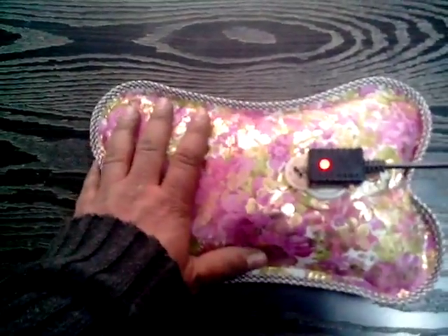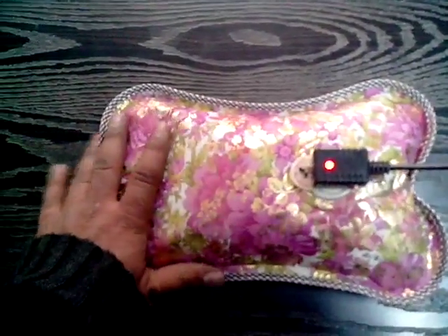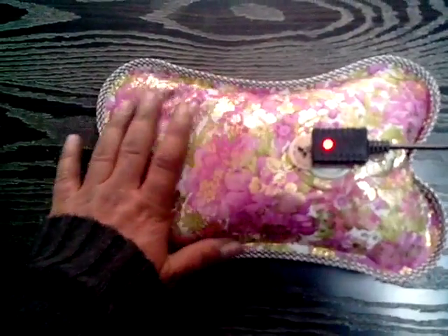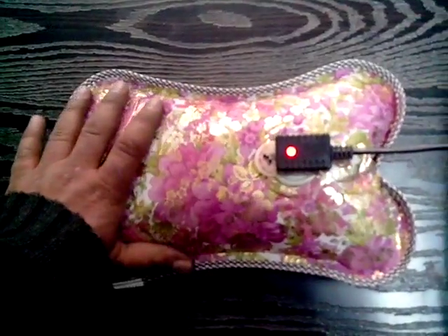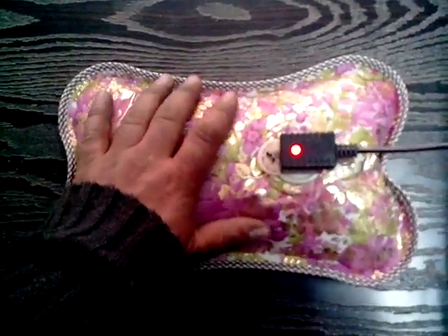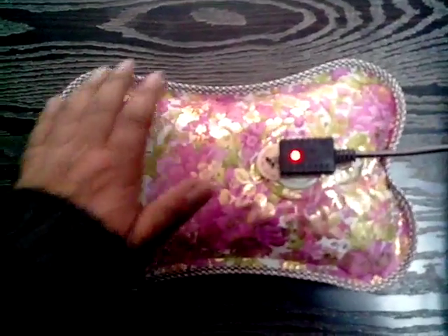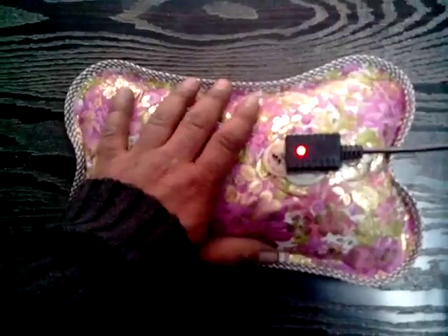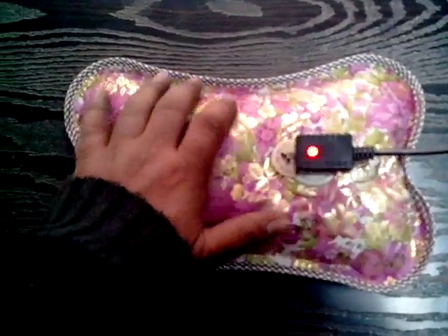This is an electrothermal bag where gel inside the bag is heated by electric current. When the desired temperature is reached, the gel starts boiling and automatically cuts off. This can be used to provide superficial heat to various joints and various body parts, better than the conventional hot water bag.